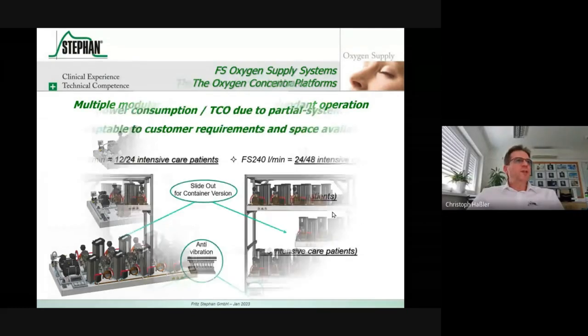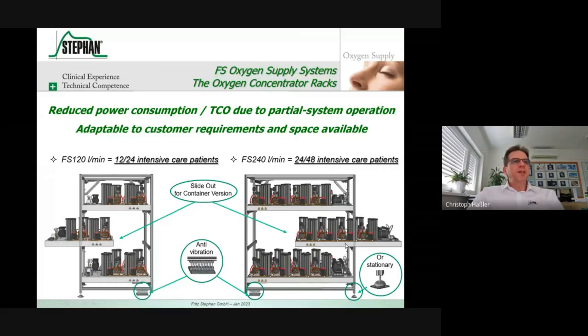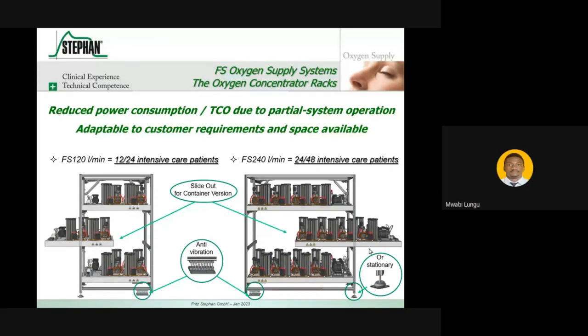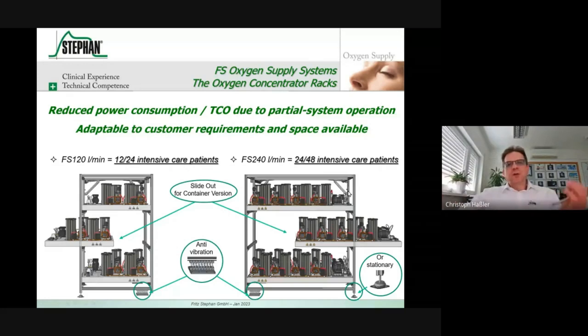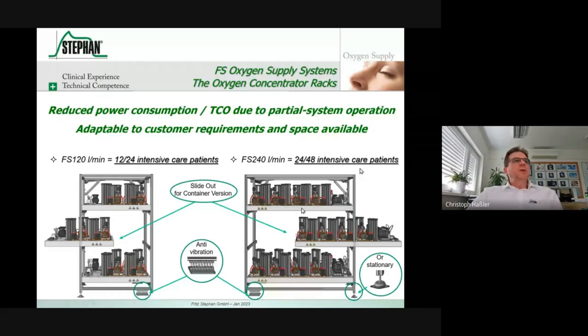Yes, good question. Thank you. Those platforms are closed, and they have two ventilators on the backside. The nitrogen-rich, depleted air goes into the cassette and is transported out of the hospital by simple tubes. In the mobile versions we have an exhaust tube that you can put outside the tent or something like that. Inside the cassette there is the nitrogen-rich, oxygen-low air, which the two ventilators blow out. Those cassettes are closed on the bottom.